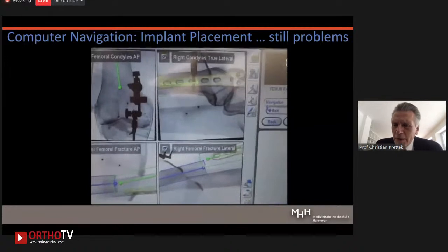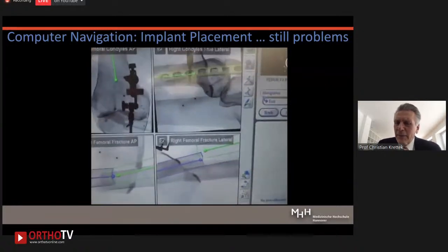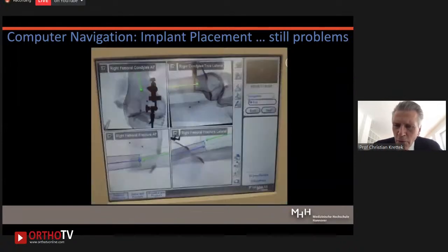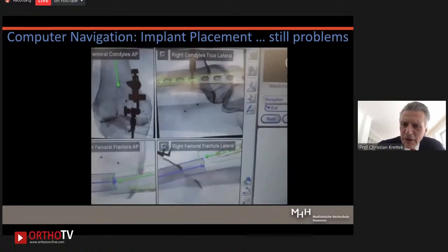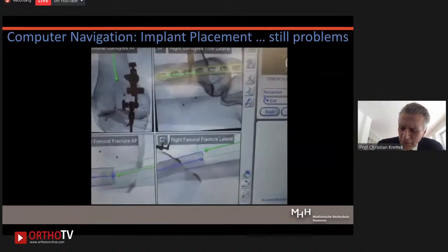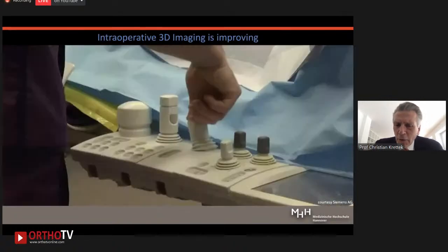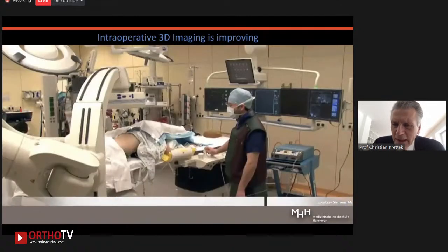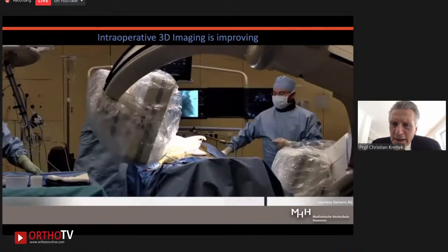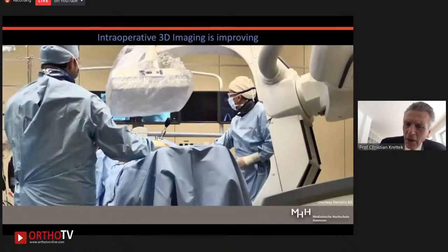But from my point of view, still these techniques are not yet so solid and reliable as we would like to have them. And I think the producers and companies still have a long way to go in order to make them not only booth proof. When you see this demonstration on the industrial booth, everything works fine. But when it gets to the operating theater, sometimes this is very different because mainly of soft tissue deformation of the reference basis. And of course, with new techniques, with closed techniques, we still need to control. So improved techniques, improved imaging techniques intraoperatively are needed in the future in order to get better and better control for the management of these injuries.